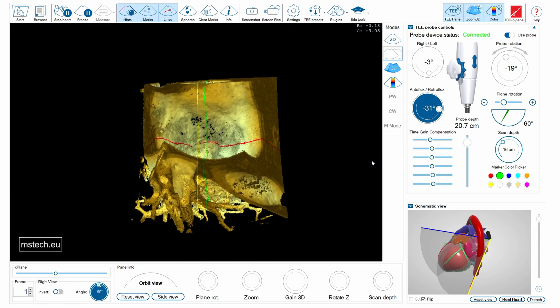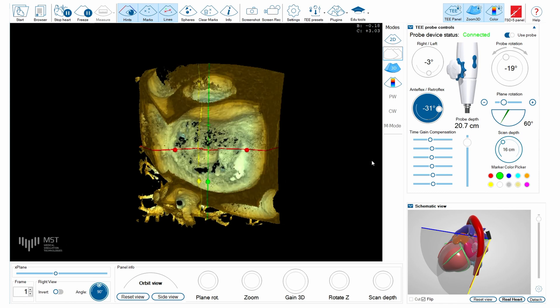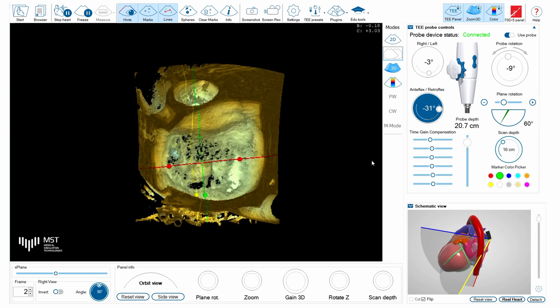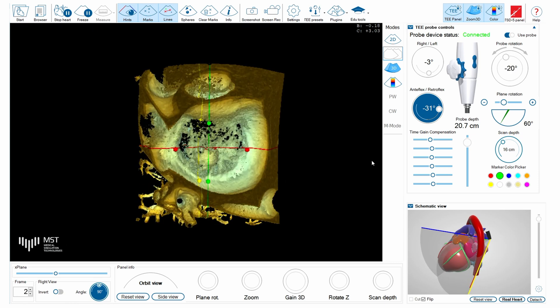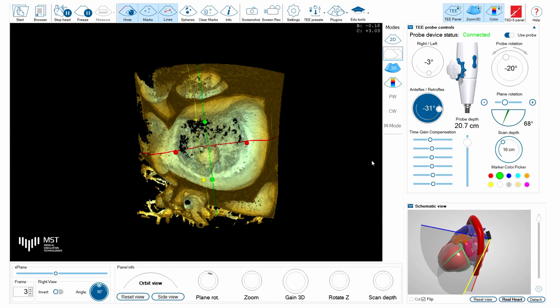This is a very good tool to practice how we should obtain orthogonal, on-axis images of the mitral valve.